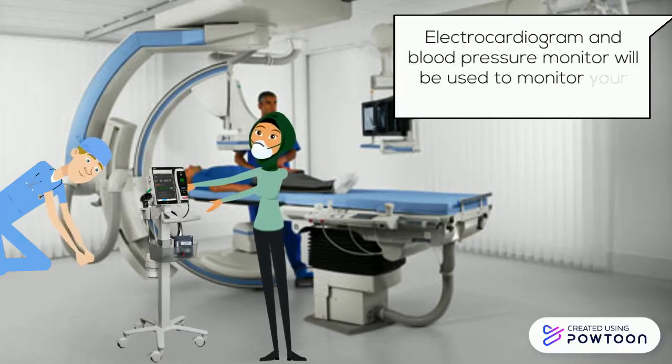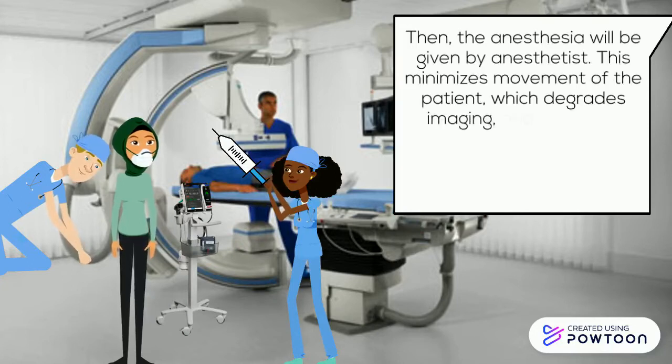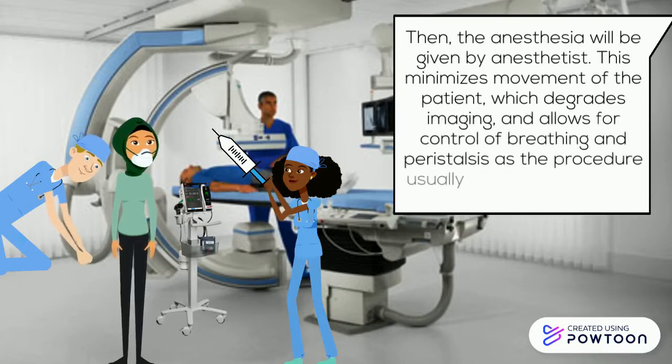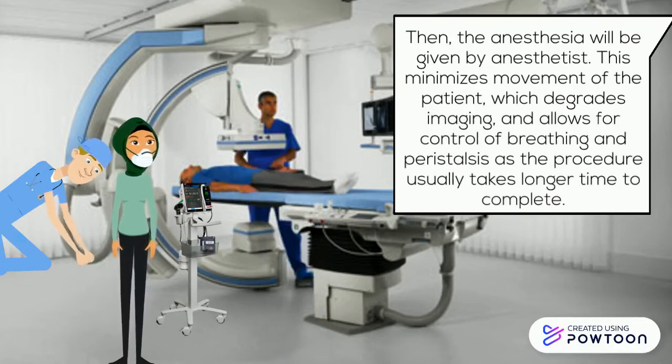Electrocardiogram and blood pressure monitor will be used to monitor your vital signs. Then, the anesthesia will be given by the anesthetist. This minimizes movement of the patient, which degrades imaging, and allows for control of breathing and peristalsis, as the procedure usually takes longer time to complete.